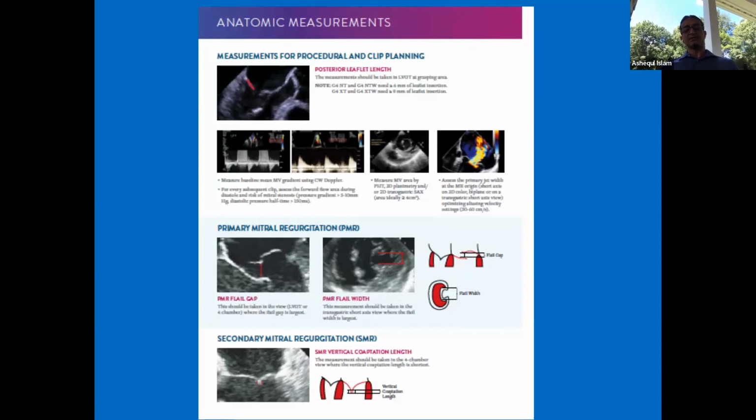mitral valve area by 3D, as well as you have to do gradients, the baseline gradients of the mitral valve. So you know where you start with, and then you basically make sure that you have repaired the valve, decreased the MR, and not ended up with significant mitral stenosis either.